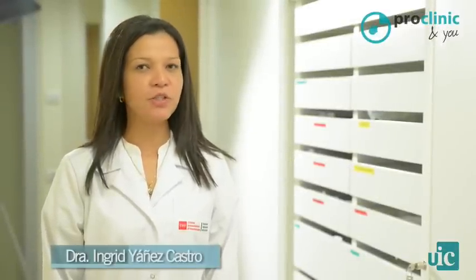Endodontic therapy is a dental treatment that involves the total removal of the dental pulp, the subsequent shaping, cleaning, decontamination, and the obturation or filling of the root canal system.